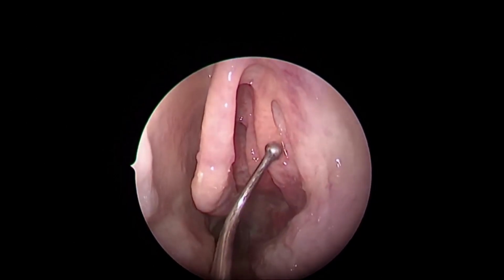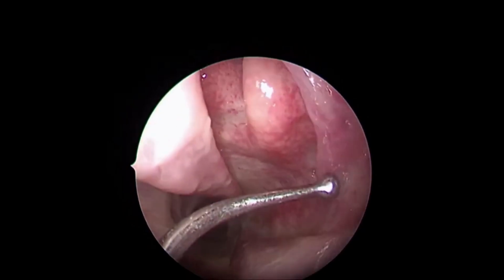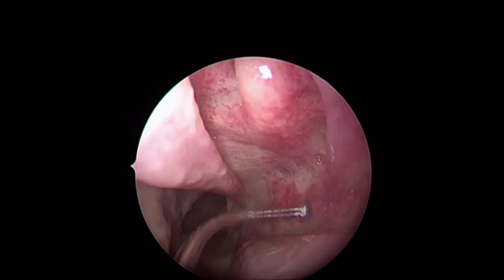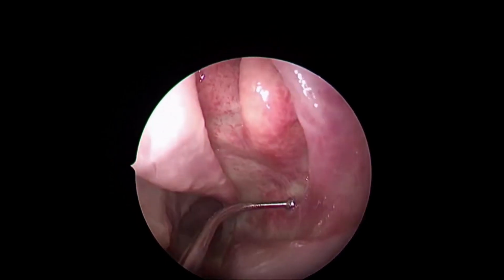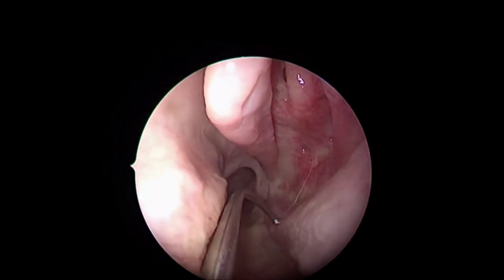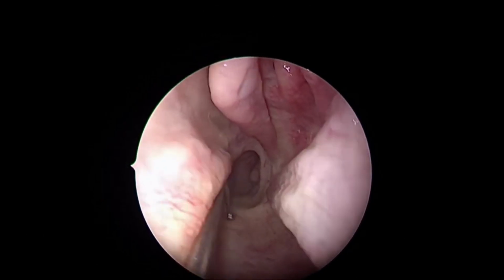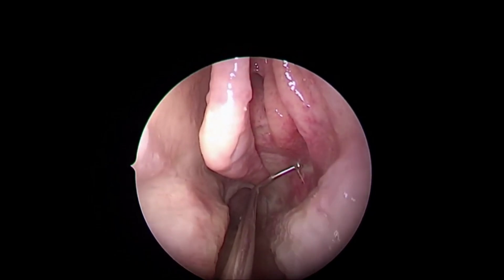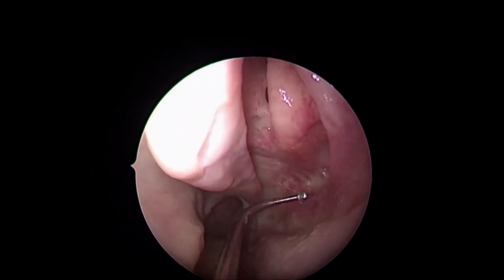It has two parts, the upper vertical part and the lower horizontal part going behind, if you follow this, to a variable distance. Sometimes it ends here in the inferior turbinate only, and sometimes it goes beyond, up to the perpendicular plate of the palatine bone. Here is the palatine bone perpendicular plate behind the maxilla, and here is the horizontal plate of the palatine bone completing the hard palate. The anatomy of the perpendicular plate is very important to understand for the sinus surgeons.